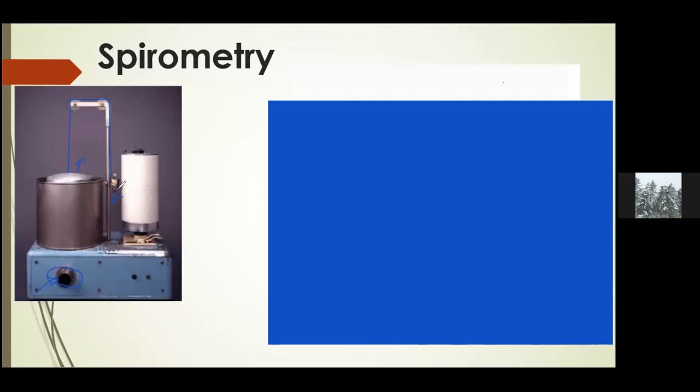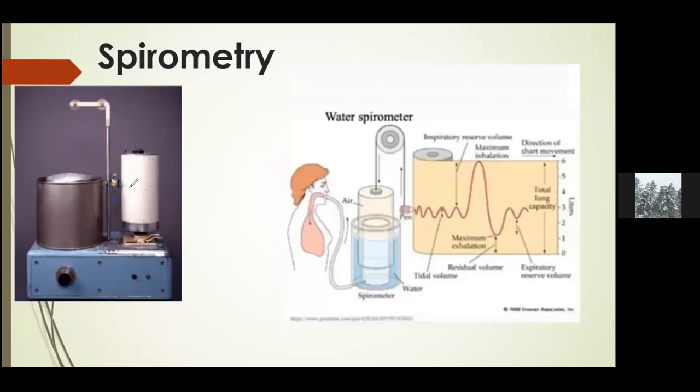Now, what you have attached to this is a transducer, and then there is a pen. This pen has some ink with which it writes on this paper. Now, if this paper is stagnant, not moving, every time you move the pen up it will go up, and if you move it down it will go down, so it will be at the same position going up and down.